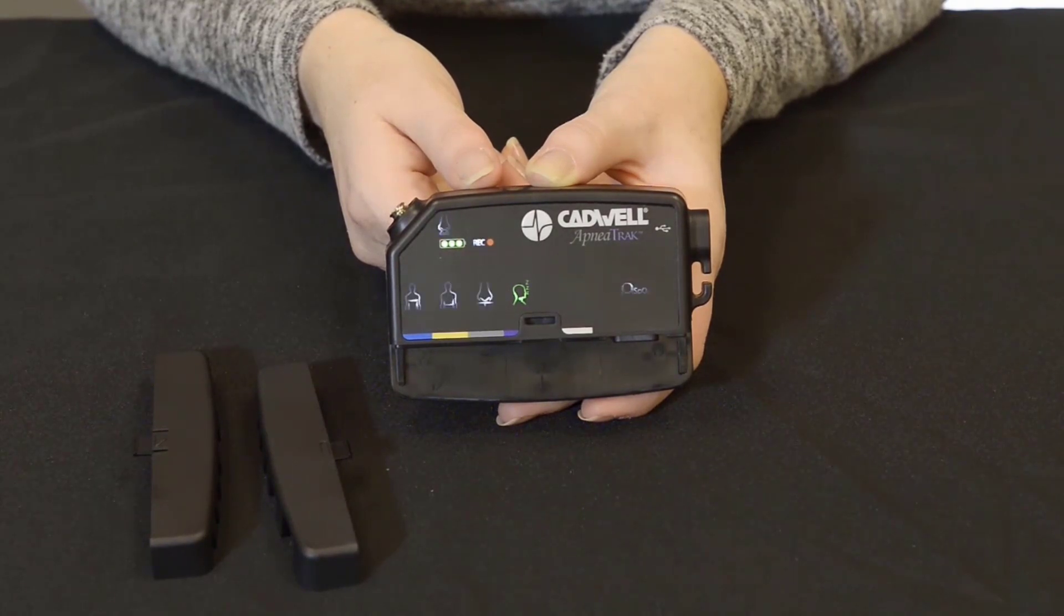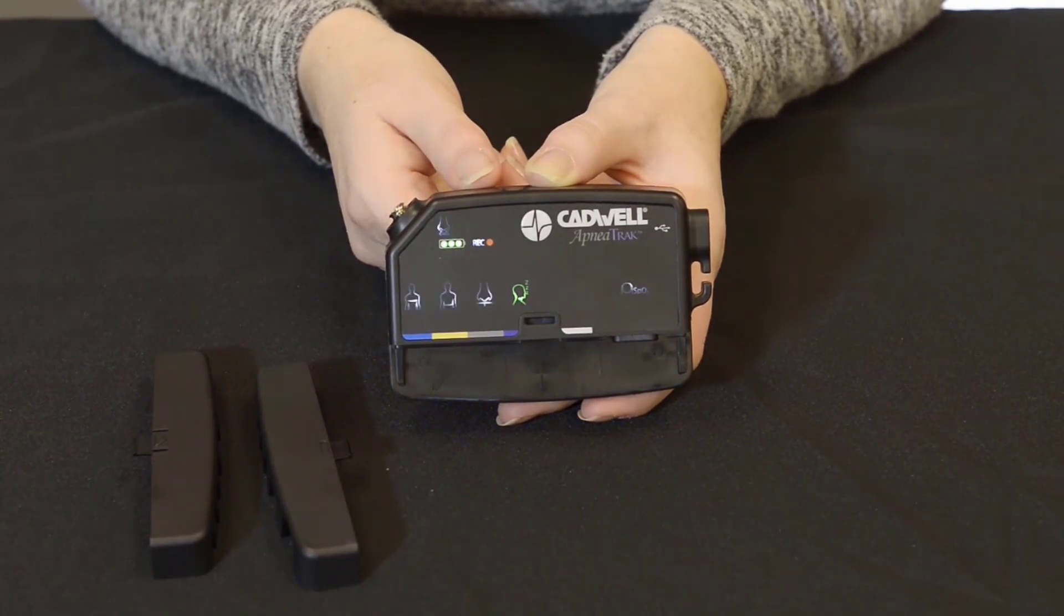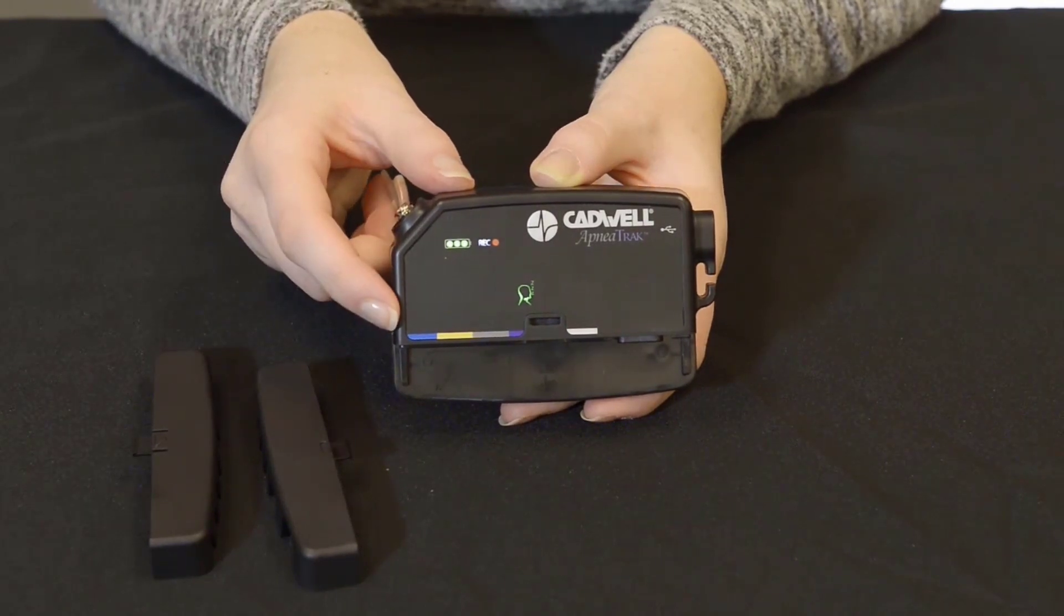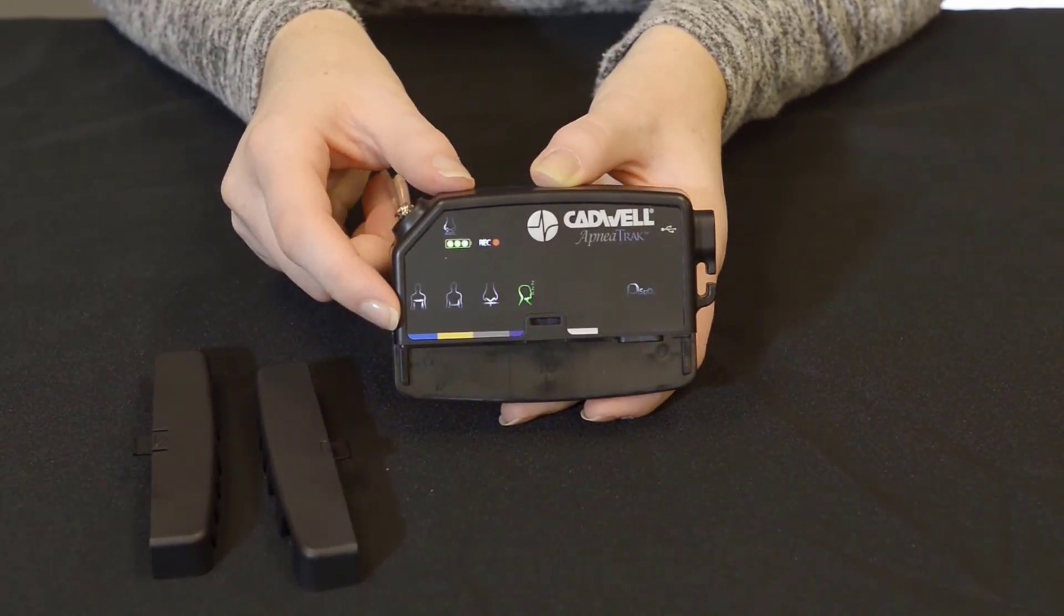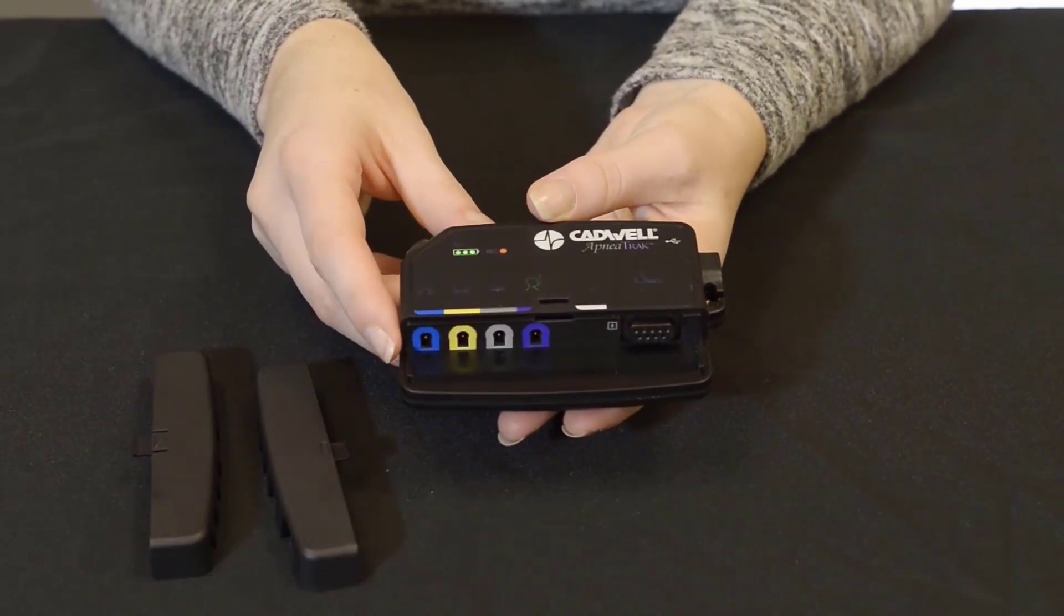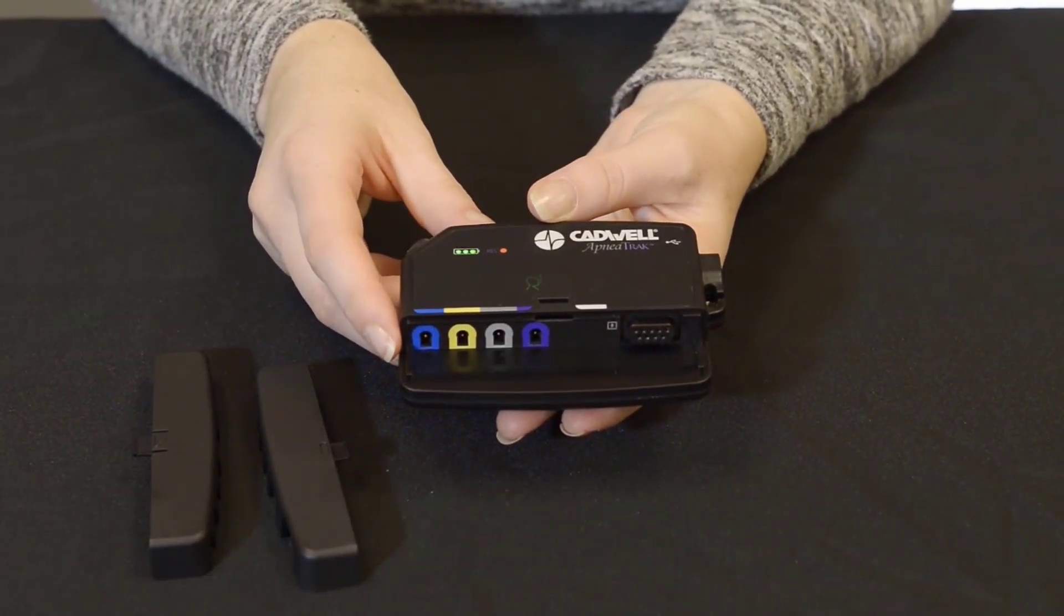The lights for the different signals use anatomical images to help indicate what the connectors are for. The inputs on the device are color coded to match the connectors for each sensor type.